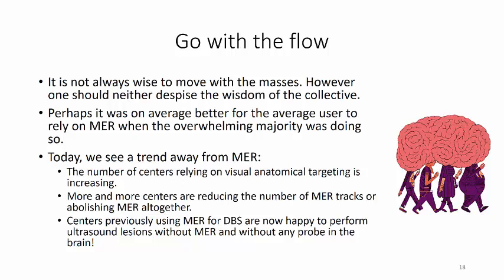We might want to go with the flow. It is not always wise to move with the masses. However, one should neither despise the wisdom of the collective. Perhaps it was on average better for the average user to rely on microelectrode recording when the overwhelming majority was doing so. Today we see a trend away from this.